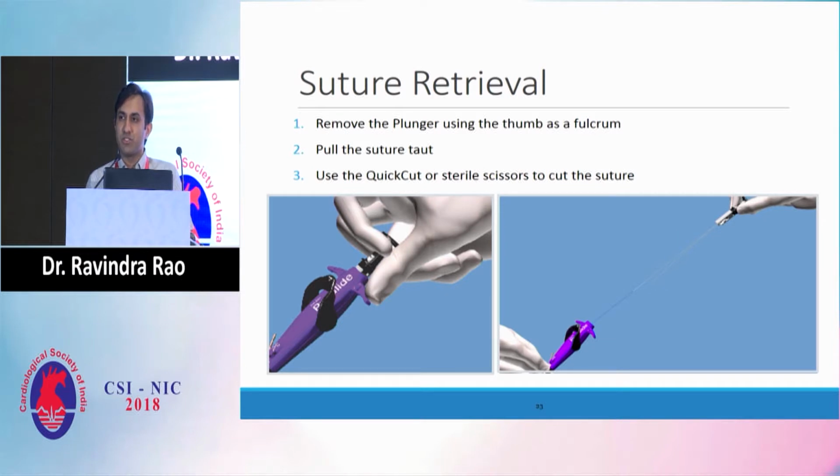The white portion basically locks the knot. So you don't touch the white part. The blue part of the thread you pull. By pulling, you deliver the knot on top of the artery. It is by pulling and not by pushing.